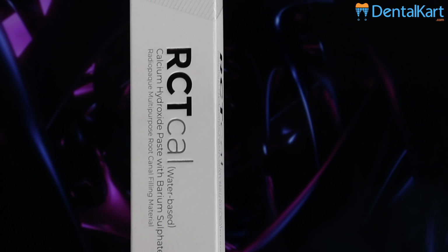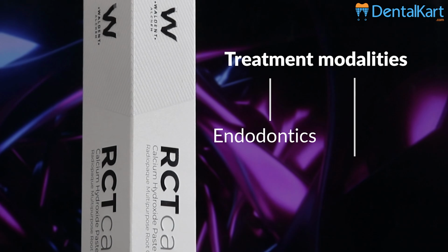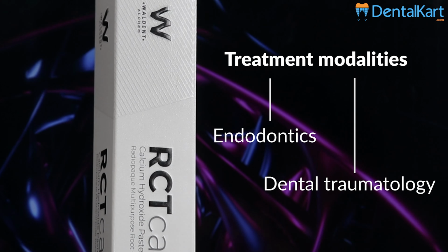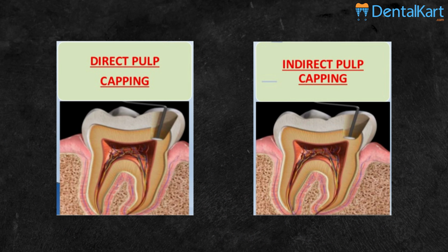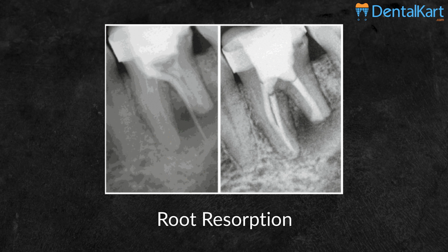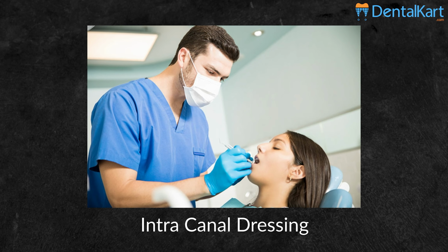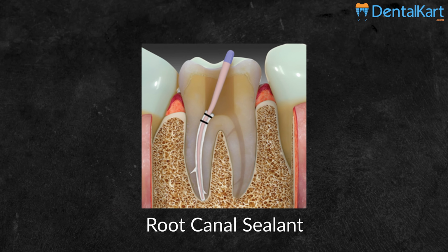Calcium hydroxide is used extensively in a variety of treatment modalities within endodontics and dental traumatology such as direct and indirect pulp capping, for apexogenesis and apexification, in treatment of root resorption, as an intracanal dressing in between appointments, and also as a root canal sealant.